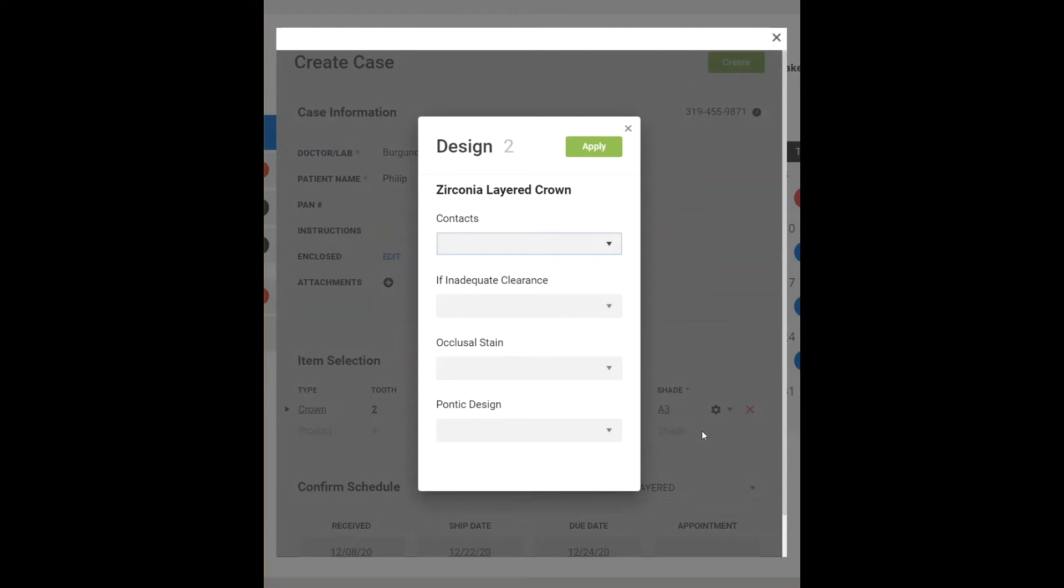LabStar provides a standard set of designs for crowns, bridges, and removable restorations. You can also create your own design selections.